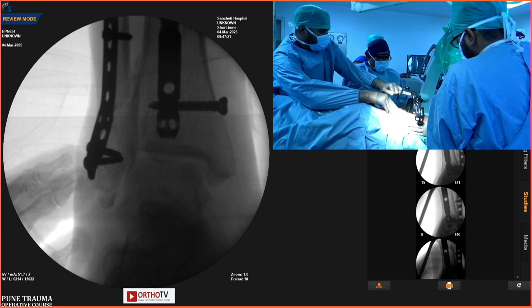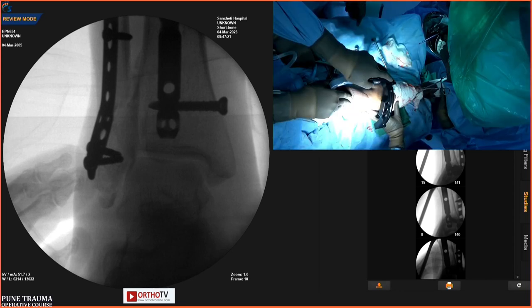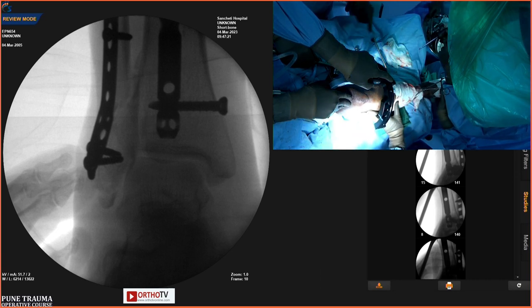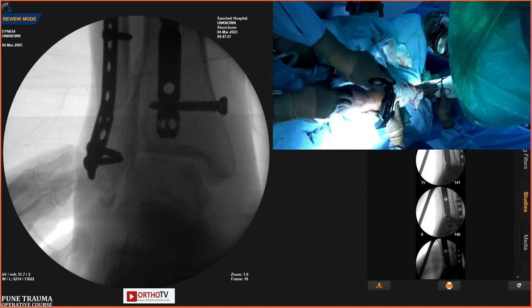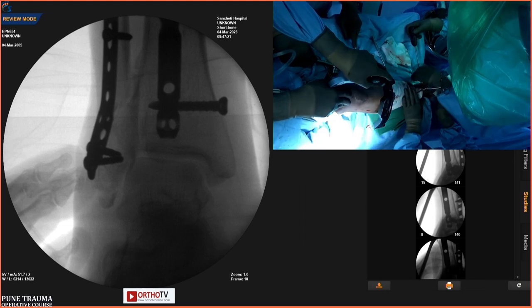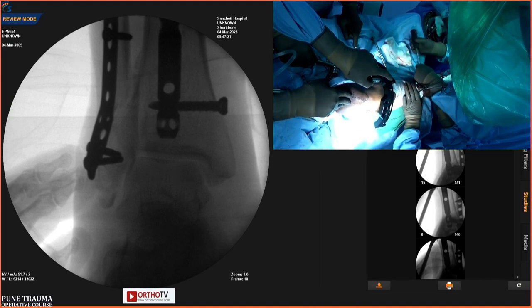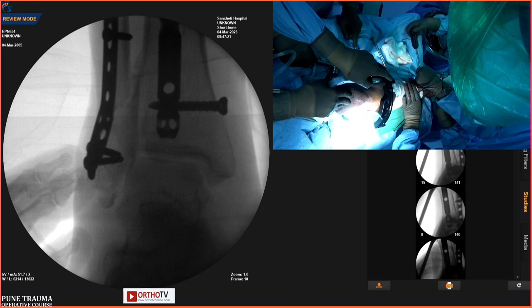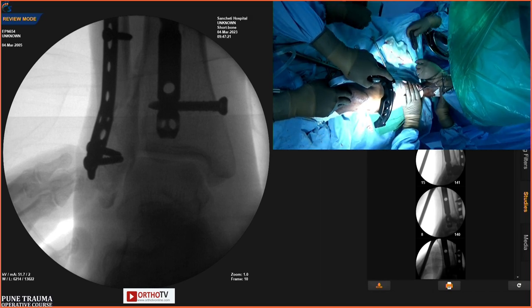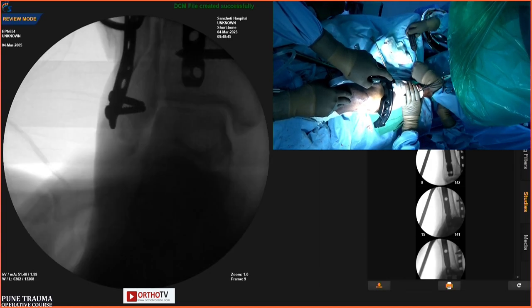Dr. Abhay, sir, excuse me, you mentioned that in case the soft tissue condition is not good, Ilizarov is being used for this type of fracture. In that case also, we plate the fibula first and then put the Ilizarov. So the basic philosophy is the same. The device you use basically has to make sure that the damage to the soft tissue and biology is minimal. So if you have a grade 2 open injury, the basic reduction technique will be the same. Instead, I will not put a plate on the fibula or just use a temporizing fibula.